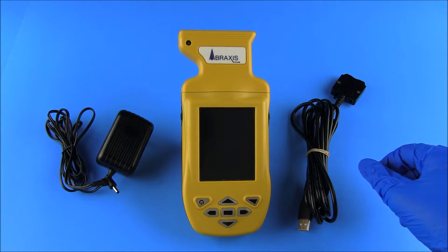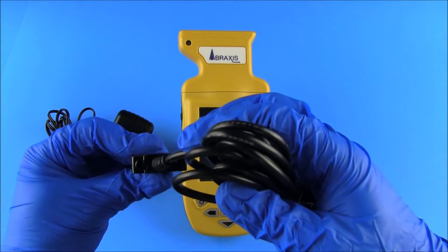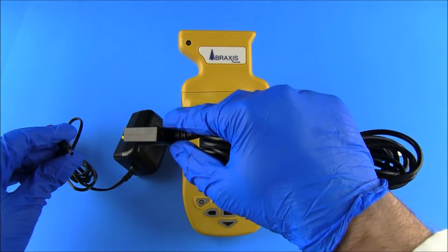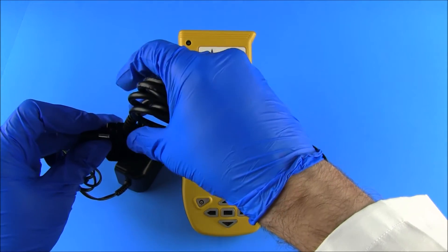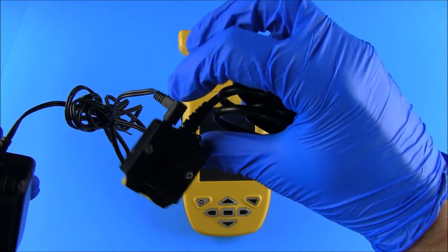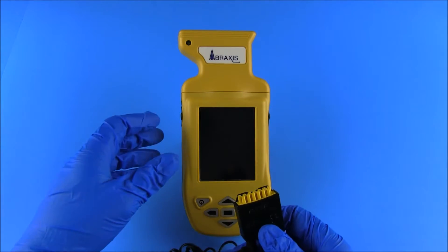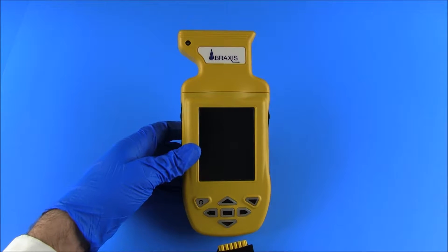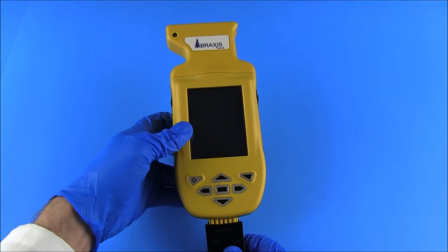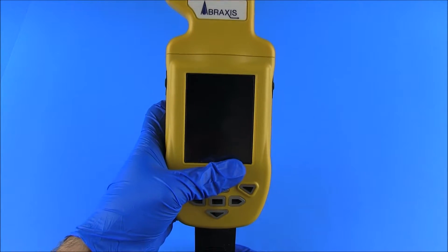The reader should be allowed to fully charge for two hours prior to first use. To charge the reader, plug the power cord connector into the port on the USB cable. The USB cable is then attached to the reader, and the power cord is plugged into the power source. To preserve battery life and ensure optimal functioning, the reader should be kept on charge or plugged in when not in use.